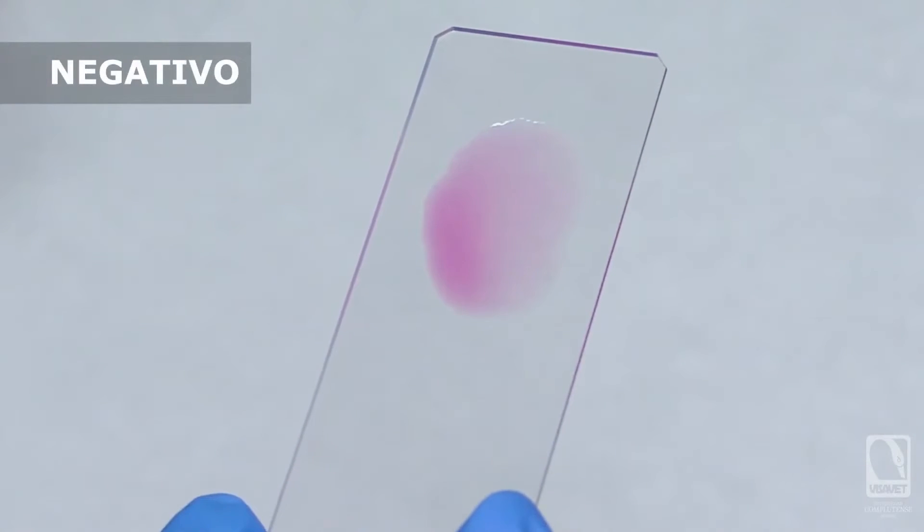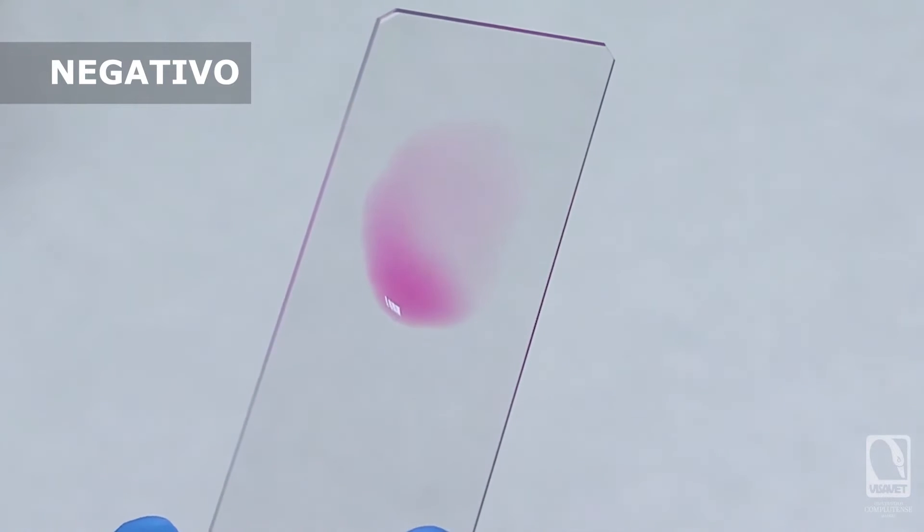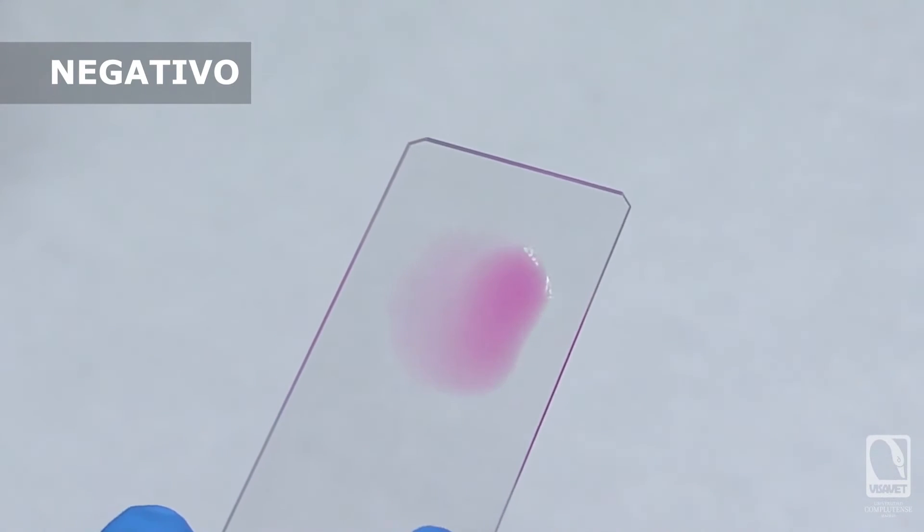If the test sample is negative, we will see on the whole surface of the sample a homogeneous pink color, without any formation of complexes or lumps.